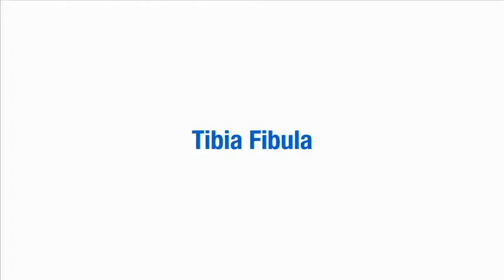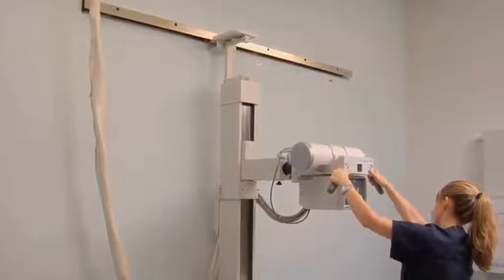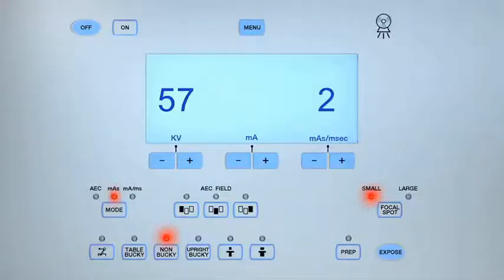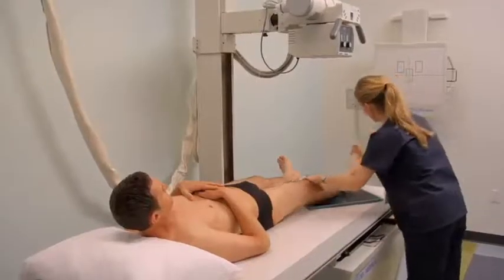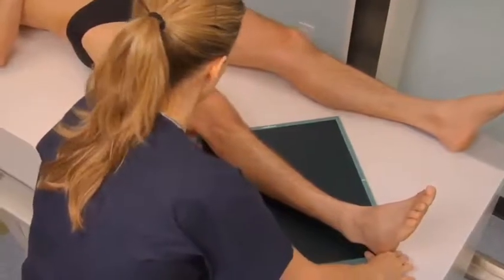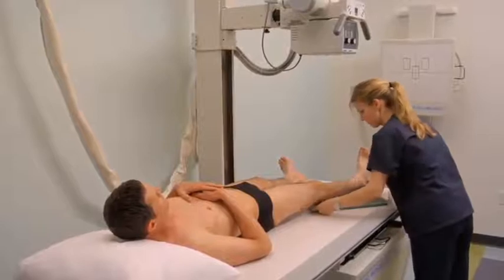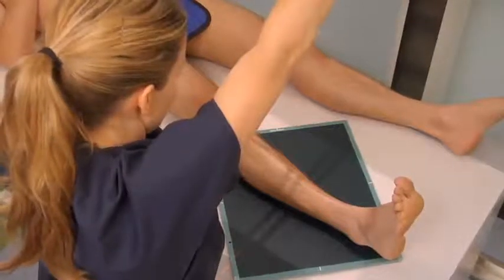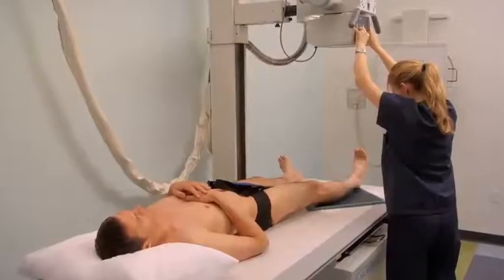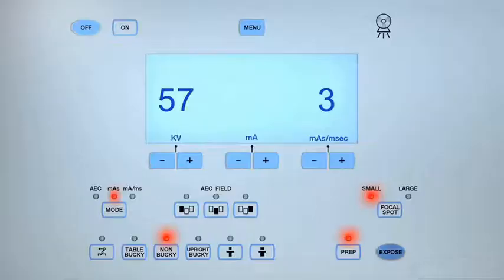To obtain an AP tibia fibula projection, set the SID and exposure factors: adjust the KV to between 55 and 60 and MAS to between 2 and 3. To decrease the effect of X-ray beam divergence, an increased SID of 44 or 48 inches and increased MAS value may be used. Select and place a 14 by 17 inch cassette diagonally on the table. Ensure the pelvis and lower limb are not rotated. Instruct the patient to dorsiflex their foot to 90 degrees where possible. Align the tibia and fibula to the center of the cassette and ensure the femoral condyles are equidistant to the tabletop; the lower leg and ankle remain in a natural position. Place a protective lead shield over the patient's pelvic area. Align the central ray perpendicular to the midpoint of the tibia and fibula. Collimate to include the knee and ankle joints, tibia and fibula, and soft tissue structures. Place the appropriate lead marker and complete the radiographic exposure.